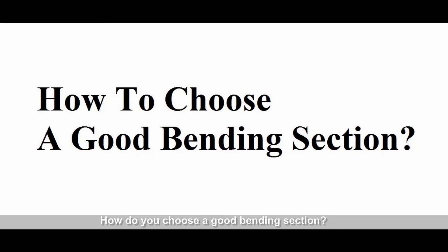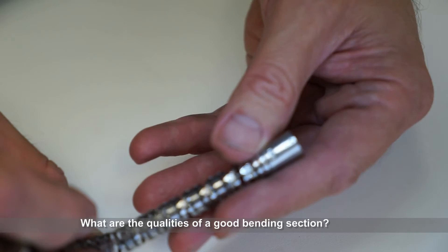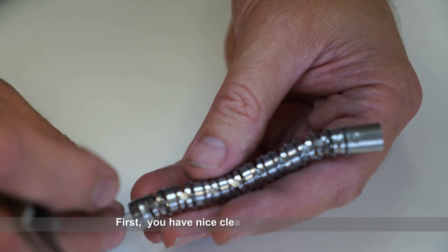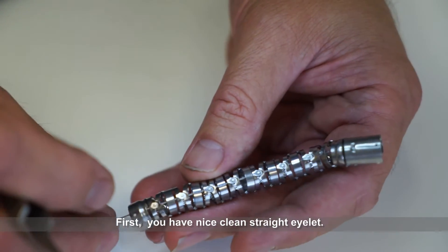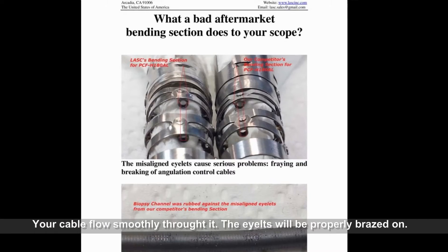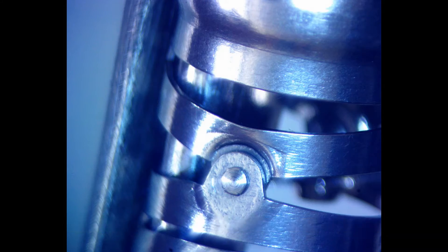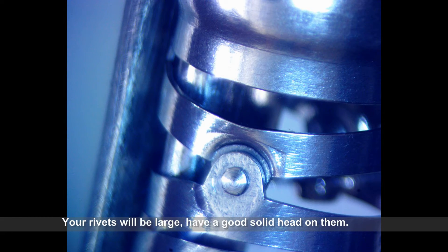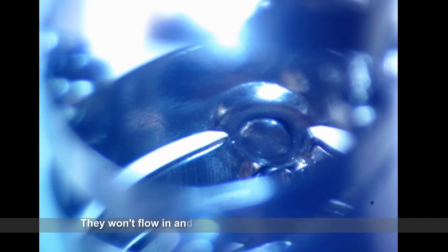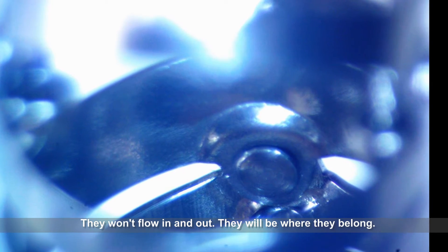How do you choose a good bending section? What are the qualities of a good bending section? First, you'll have a nice clean straight eyelet — your cable will flow smoothly through it. The eyelets will be properly brazed on with no sharp edges. Your rivets will be large, have a good solid head on them, they won't float in and out, they'll be where they belong.